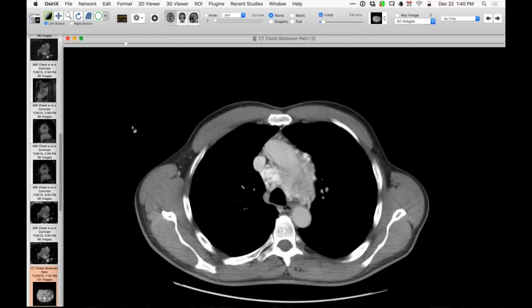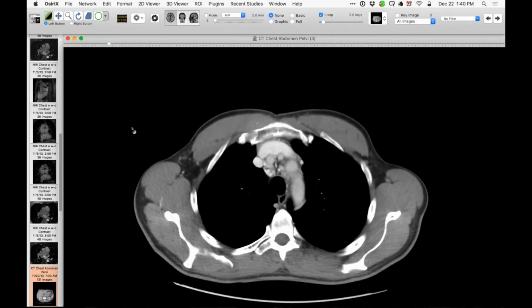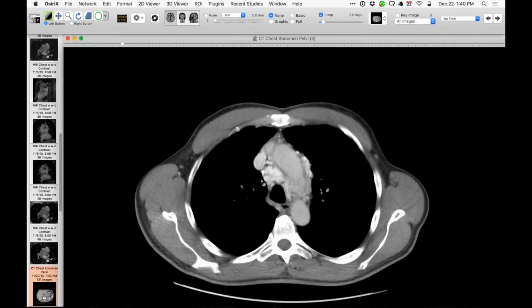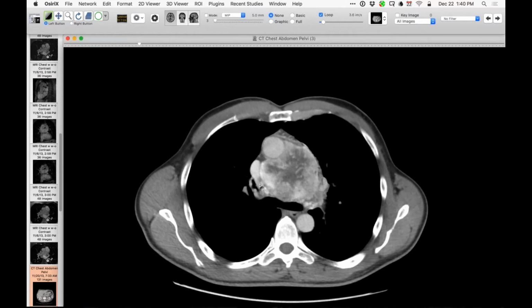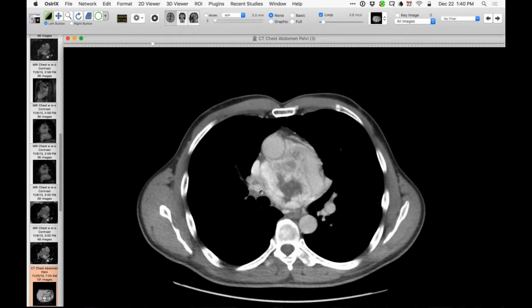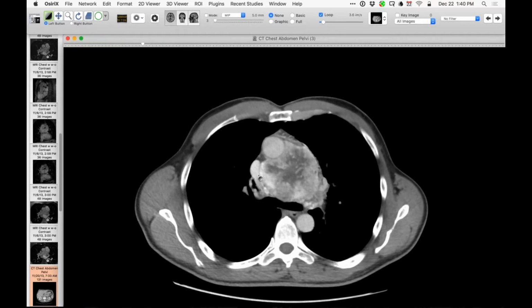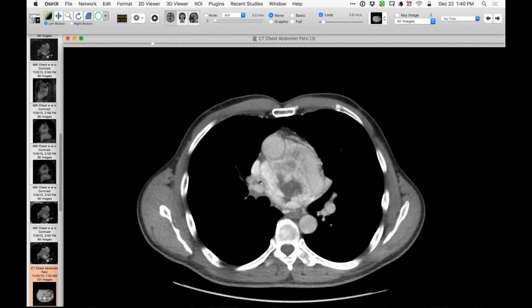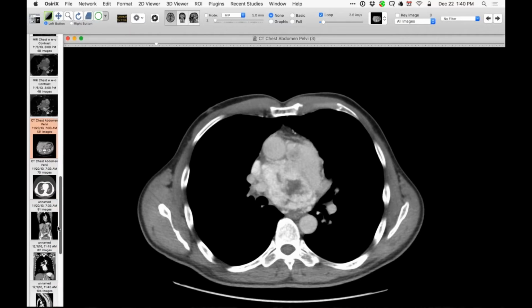So, of course, this was biopsied, and this turned out to be a paraganglioma. You can see up here it's got some really big vessels supplying its superior portion. So, very vascular thing. So we had that resected. They had to sacrifice the left recurrent laryngeal nerve. In order to get that out, according to the notes, they had to do a patchplasty of a pulmonary artery in one place. But otherwise, they got it out. And his CLL is doing just fine.